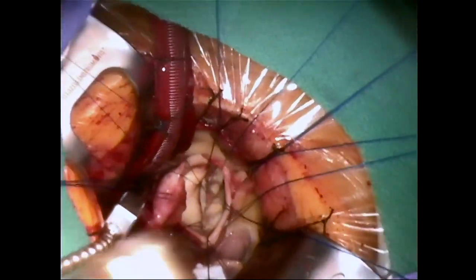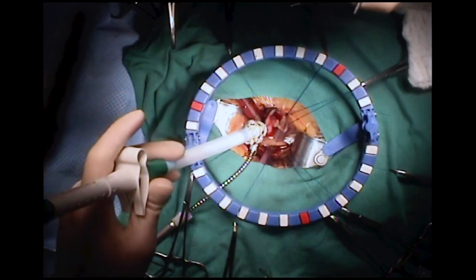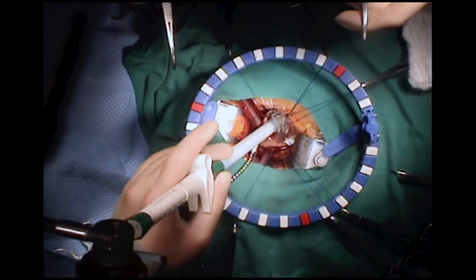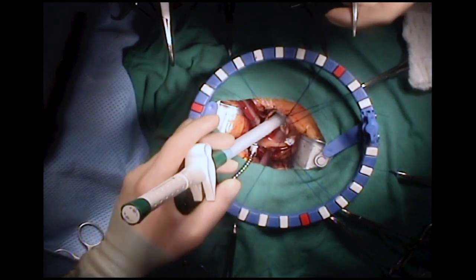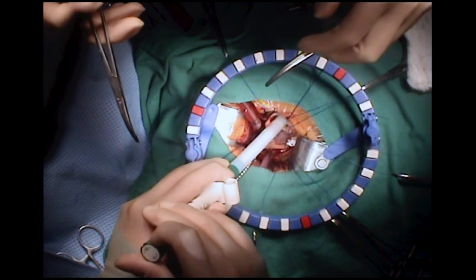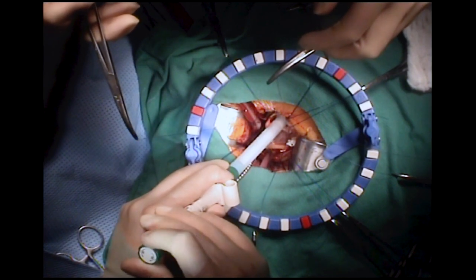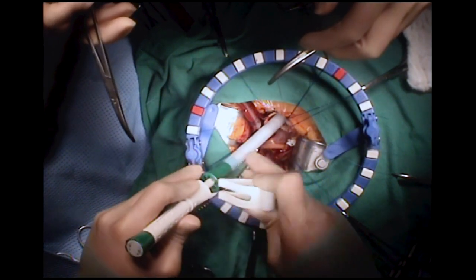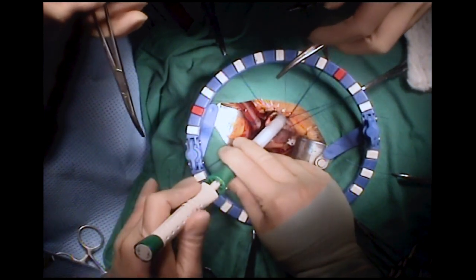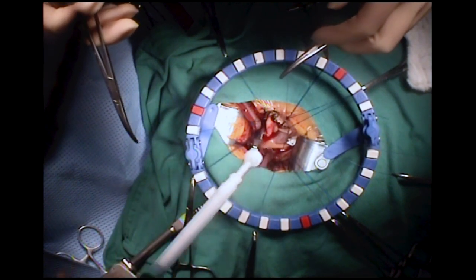Sutureless aortic valves are increasingly being implanted. The sutureless aortic valve is now placed at the nadir of each cusp and the valve is then released in the prescribed fashion.